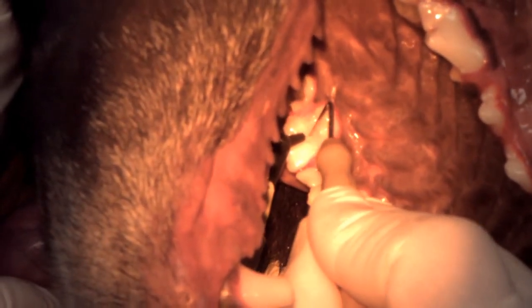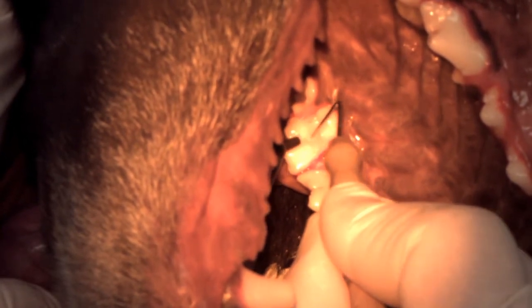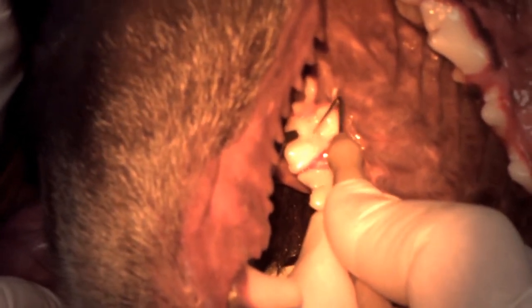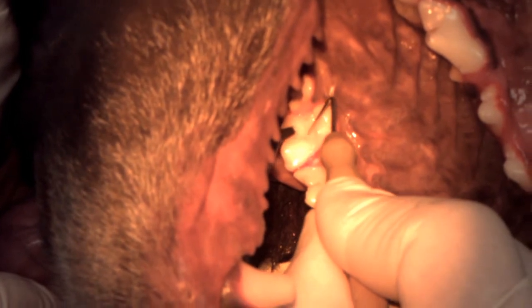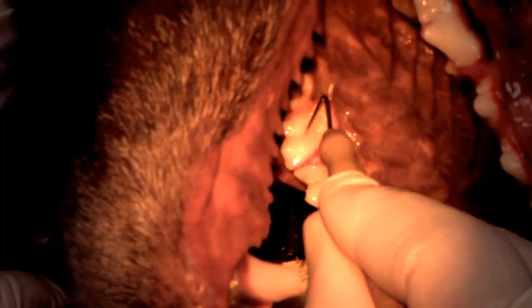A little bit of composite — doesn't take much. We don't want to overfill; when this dog bites down, we don't want the molar to hit a high point in the restoration. That would be very uncomfortable. If anybody's ever had a high filling, you know what I mean.